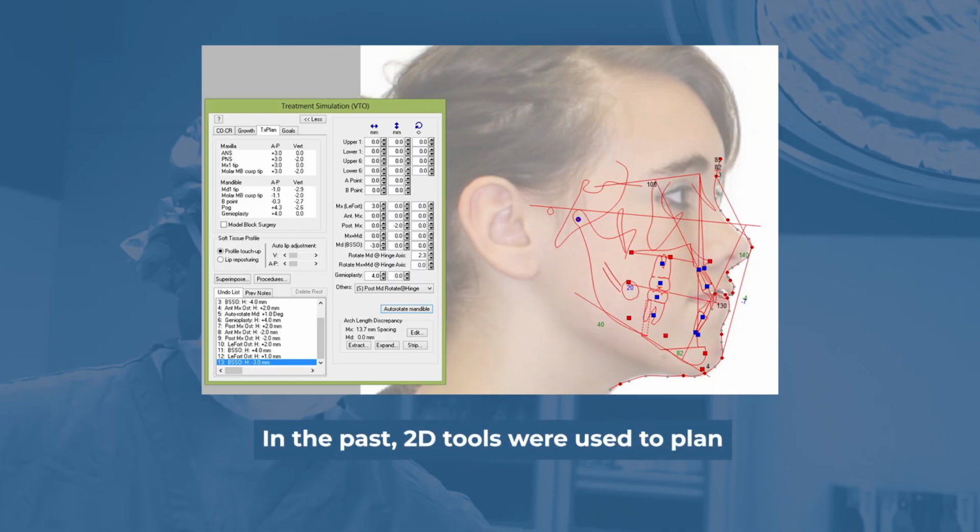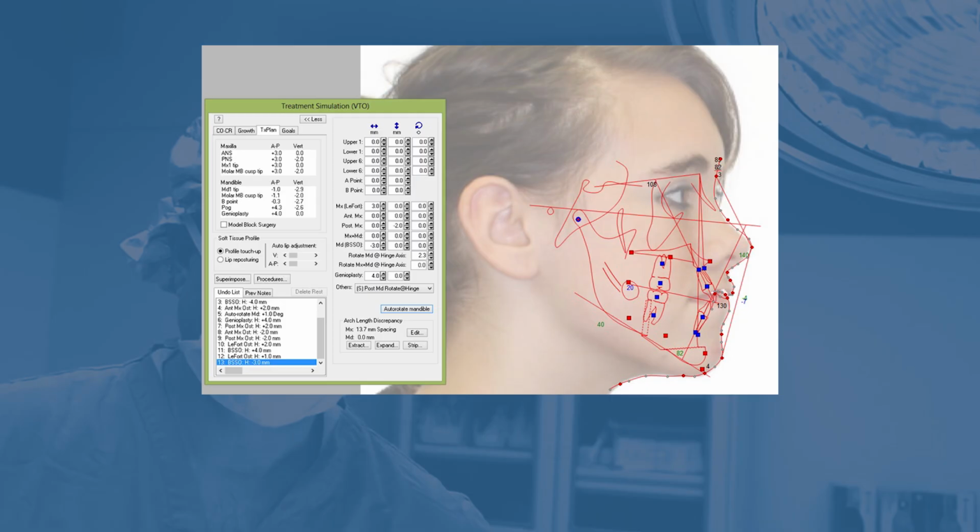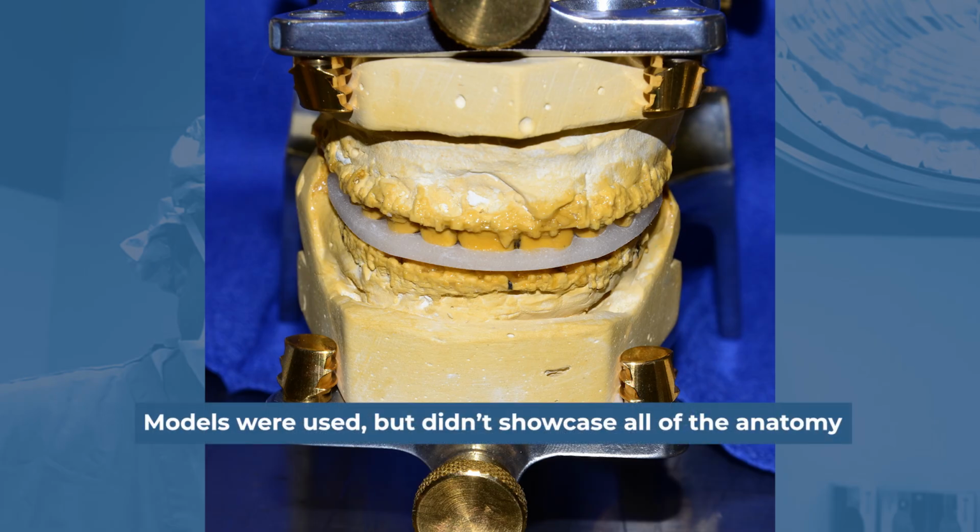really directly interlinked. So you would look at the patient and have sort of an understanding of the morphology or diagnosis. You may get a two-dimensional X-ray. You may get a plaster mold of the teeth, and then you would try to integrate these together. Frequently it involved having these stone models mounted and directly manipulating these in space in a laboratory.